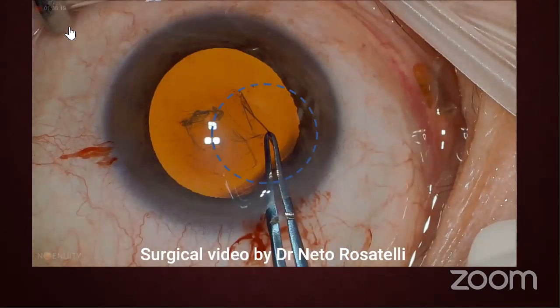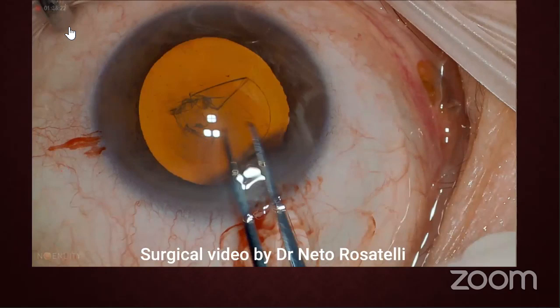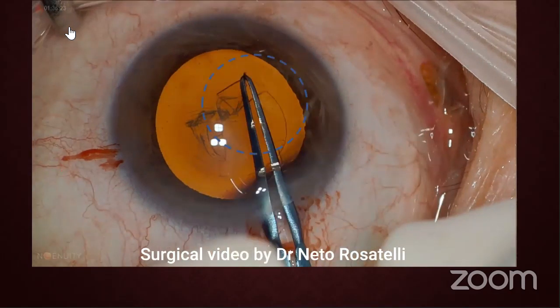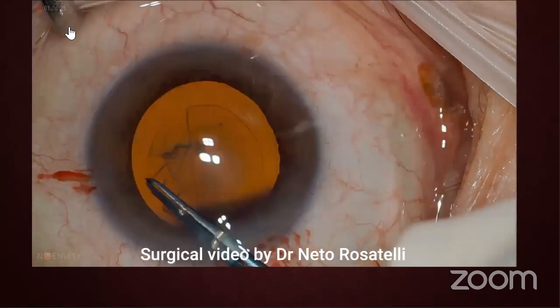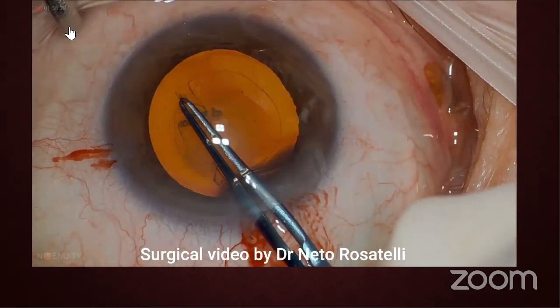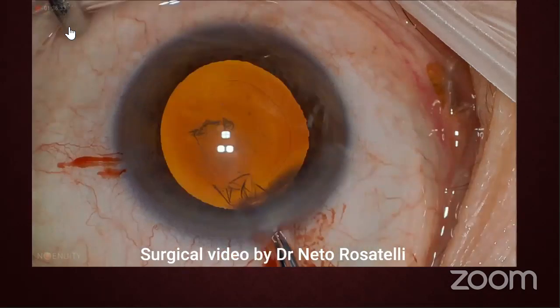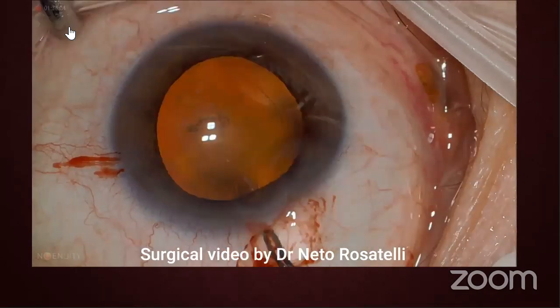Now, for using forceps doing CCC, the rule you have to follow is that your forceps tip should follow the size of rhexis. That means if you imagine the CCC, that's the circle that the forceps has to follow. And also look where the capsulorhexis forceps is holding the cut edge. It is not very close to the CCC margin, and it is not very far away as well.